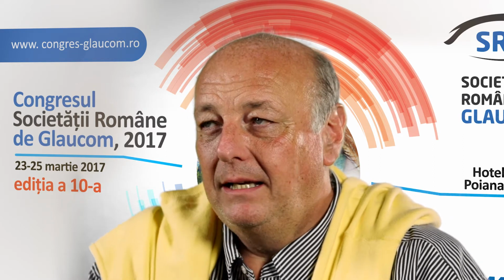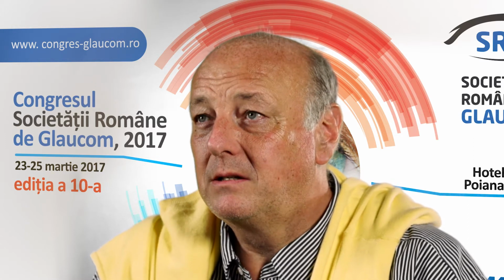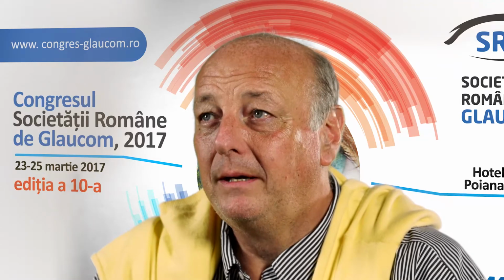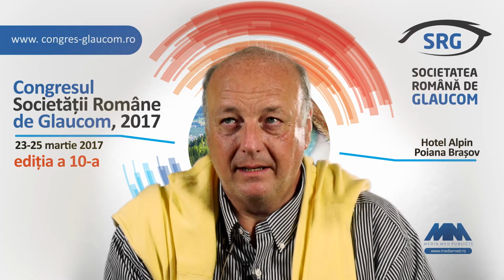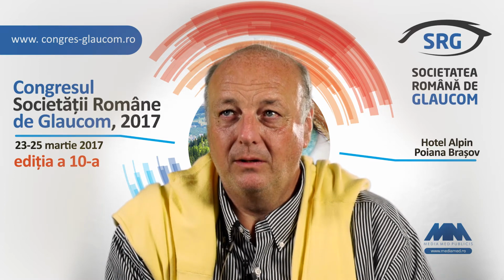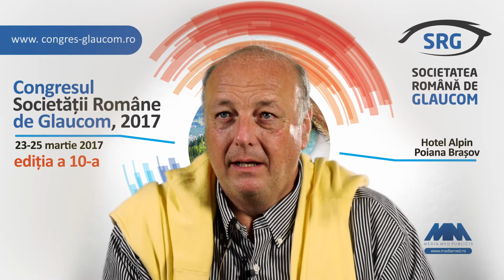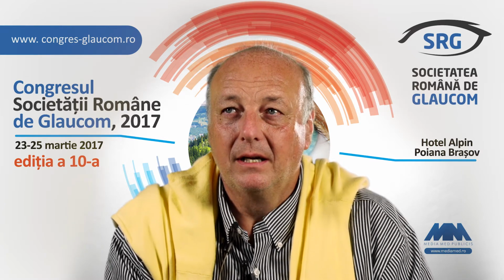But on the other side, if you know it once, then it's really no problem to do so. And it's elementary to have the right diagnosis of glaucoma. The second talk was about the importance of visual field testing, which is another essential examination that you need to perform. You make visual field testing with computer-assisted systems.